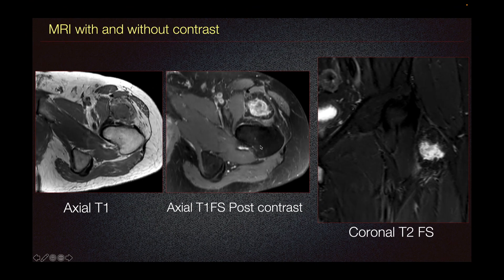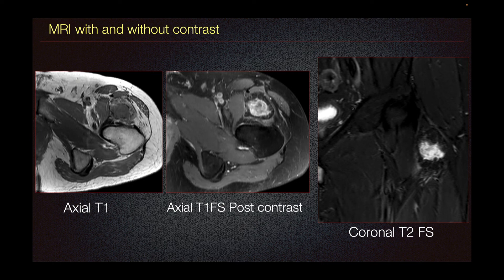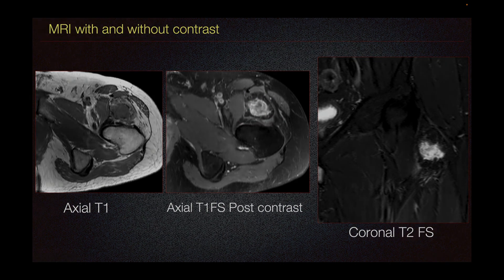The periphery has the same signal as the bone, which is also seen on coronal T2 fat sat imaging, where the mature bone suppresses on fat-suppressed imaging. This is a typical appearance of myositis ossificans in its later stages, where it can mimic bone. The ossification starts from the periphery and progresses centrally as it matures and becomes completely ossified.